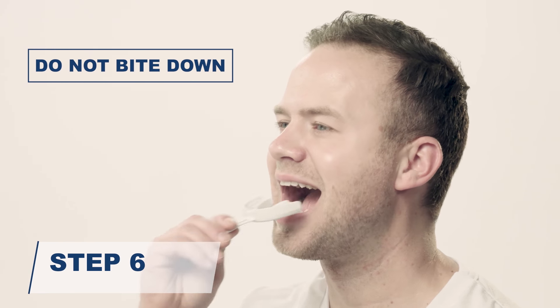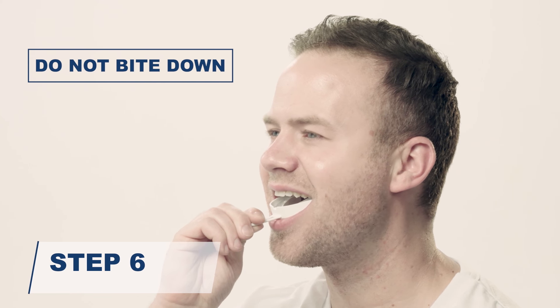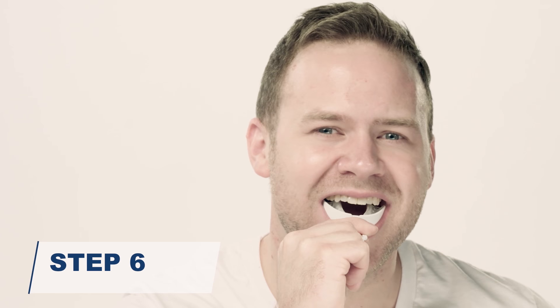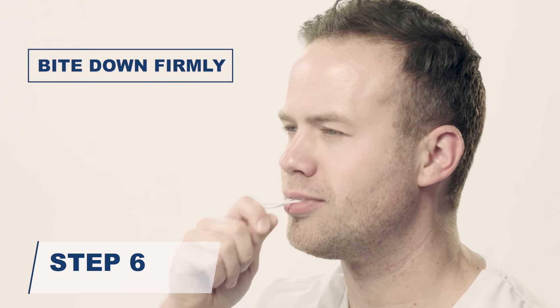Immediately pick up the guard by the handle on the forming tray and place it into your mouth. Do not bite down. While looking in a mirror, center the dental guard below your two front teeth and the sides below your molars. Bite down firmly into the guard.